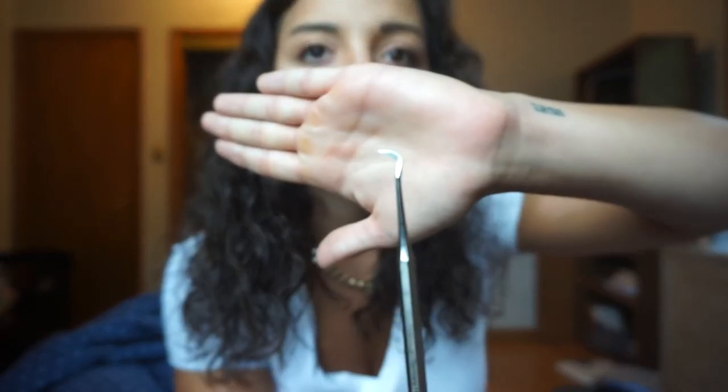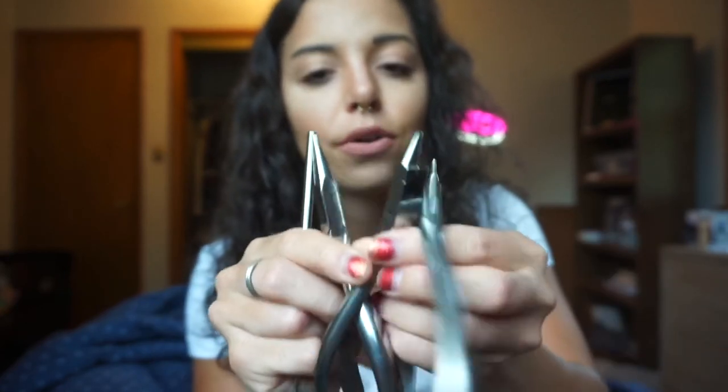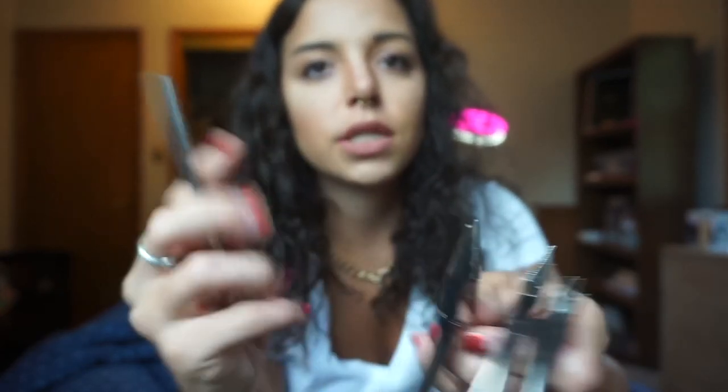The last instrument in the retention setup is a scaler. This comes in the retention setup because when a patient comes in and has a glued-in lower lingual, we take it and push down on it to make sure the lower lingual is not loose. There you have it — all the instruments in the retention setup.